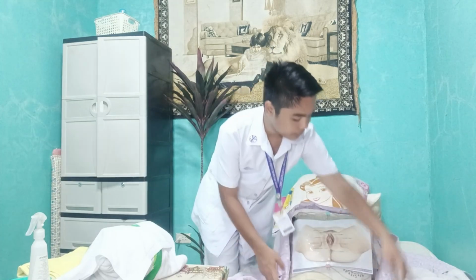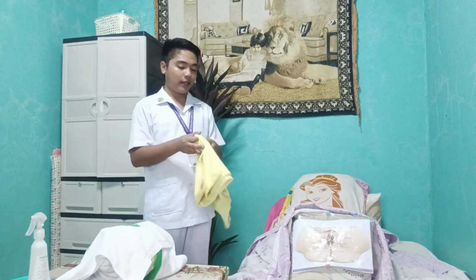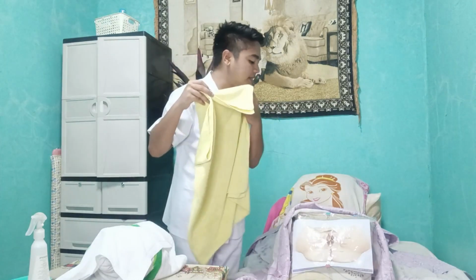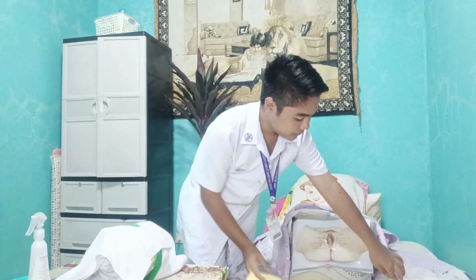Okay, thank you. So after that, I am going to place a bed pad underneath so that our bed will be protected from dirt and soil. Ma'am, can you please lift your buttocks for me? Okay, thank you for lifting your buttocks. All right, so now provide direct light for the visualization of the genital area. Next, I am going to open my tray set and arrange the equipment accordingly for convenience and to maintain sterility.